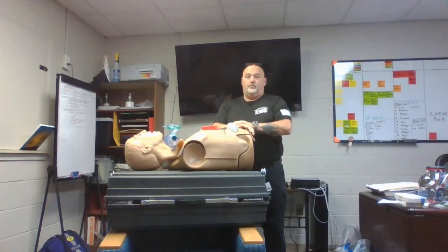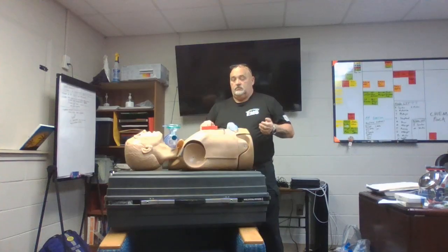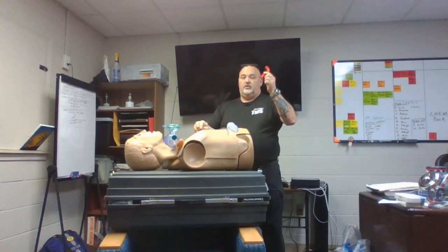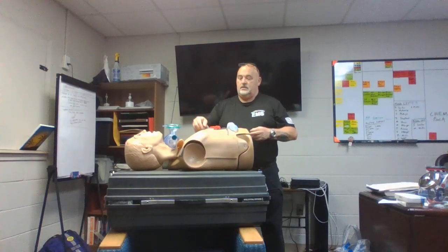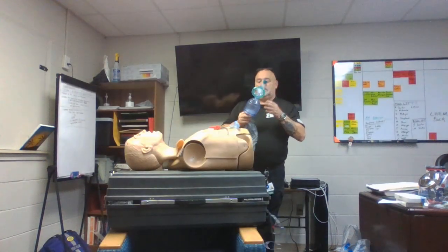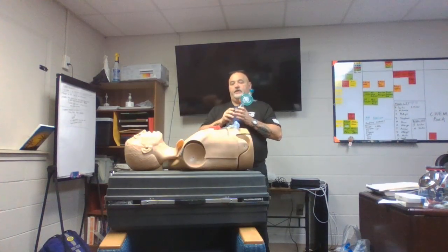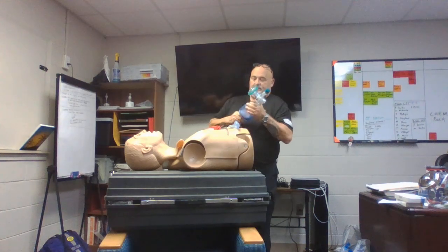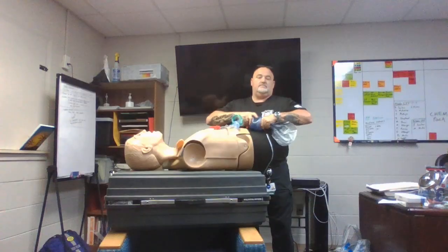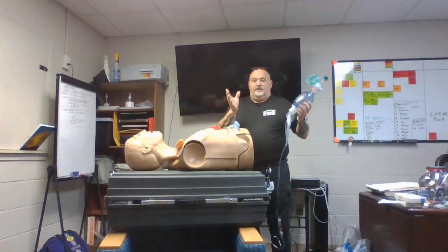So, with that being said, by the time we get done, we're going to know when and how to suction, and when and how to place and measure OPAs, NPAs, BIADs, and everybody's favorite, the adult bag valve mask. People see these and they automatically assume that we know everything about them and know how to use them. That is not the case. If you notice, this is a small bag. Our agency and some other agencies have switched to the 500 bags instead of the big adult bags.